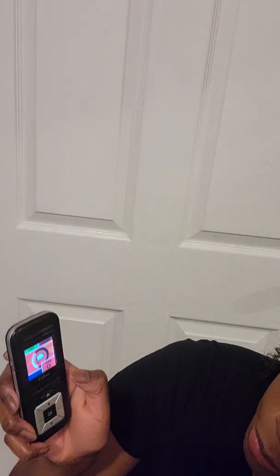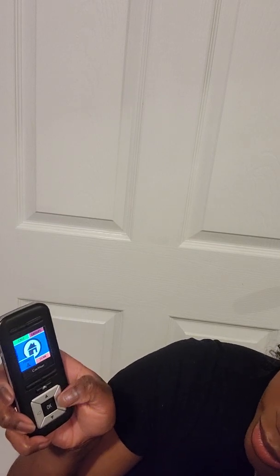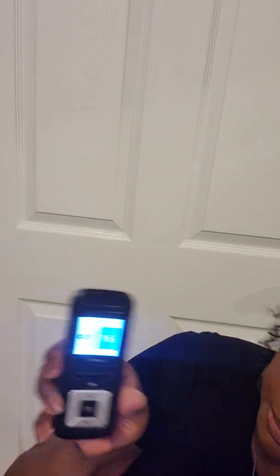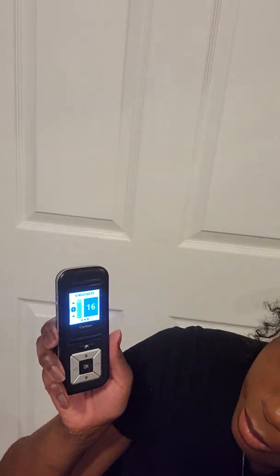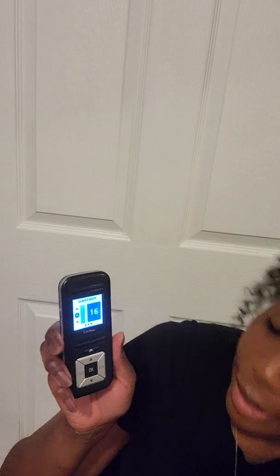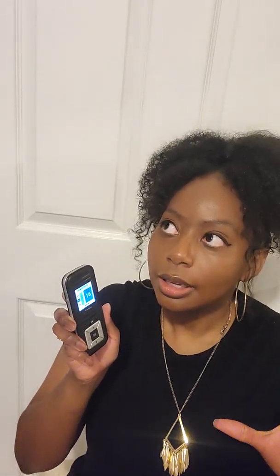Okay, so I'm going to go over once more. Wait, I'm sorry, I wasn't trying to go there. Okay, so this part, sensitivity, is basically how this works. Whatever you're hearing, it makes it sound like it's coming closer to you or further away from you. If you're hearing something and you want it to sound closer, you would just adjust the setting.